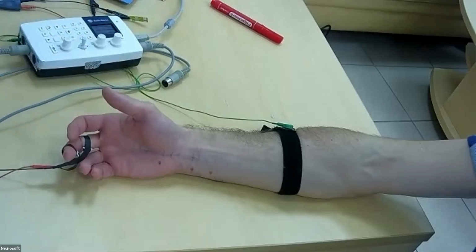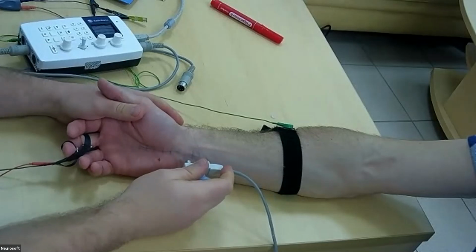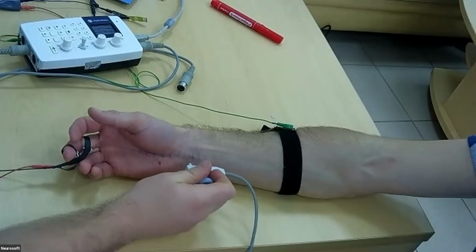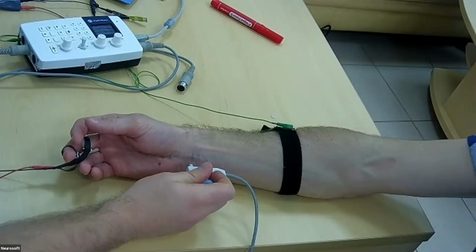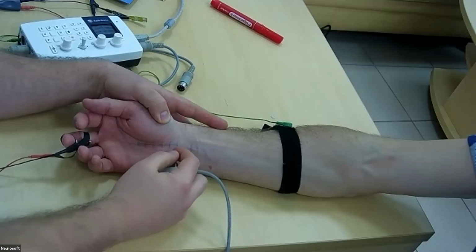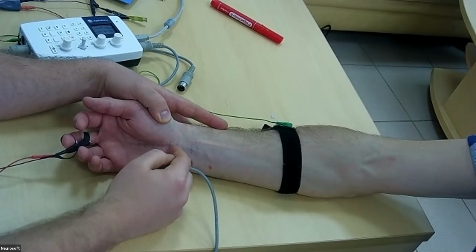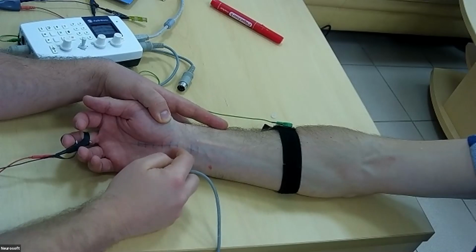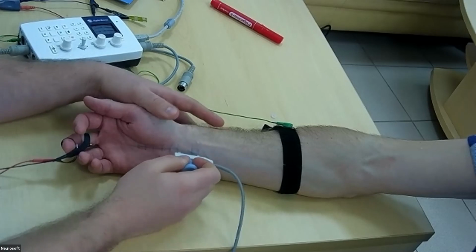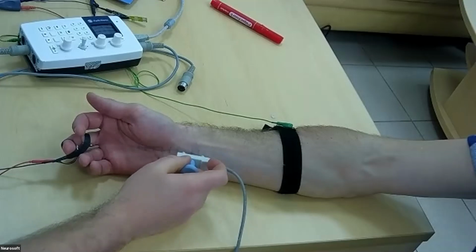So now, usually inching methods are developed after the normal sensory conduction velocities. The method is connected with gradual change of position of the stimulation electrode, in both ways, proximally and distally from the wrist.